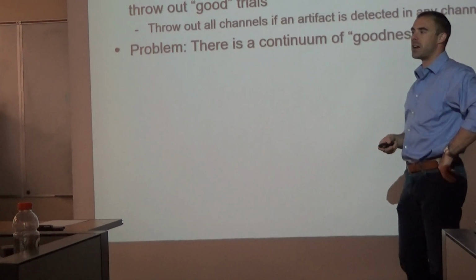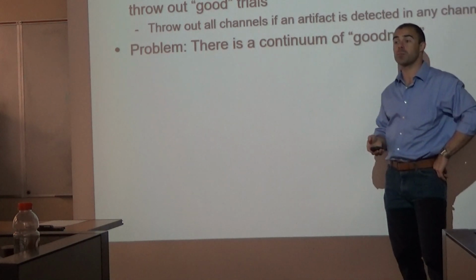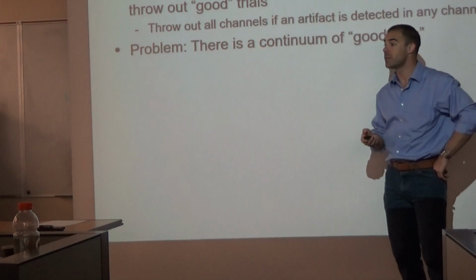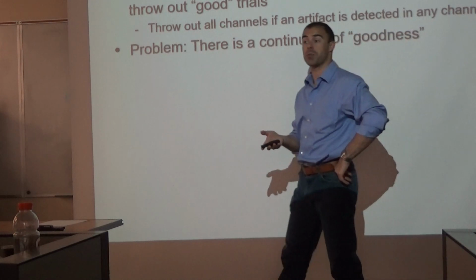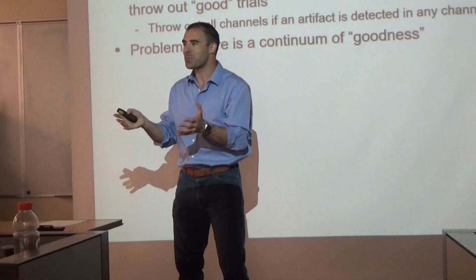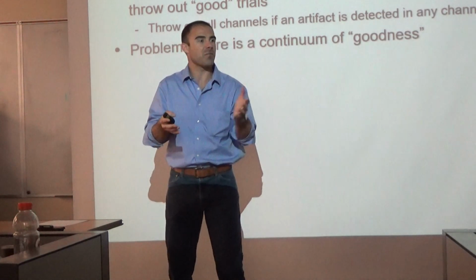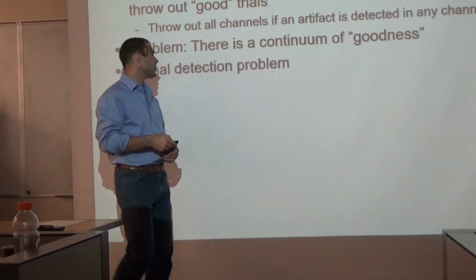Okay, sometimes there might be some EMG activity that could be perfectly fine to include because it'll average out over hundreds of trials. And then there might be some EMG activity that's really horrible and you definitely want to throw it out, right? Well, what about somewhere in between, right? There might be some EMG that's pretty bad, but how do you decide, right? Everybody's decision criteria might be a little different. So you have some issues there.